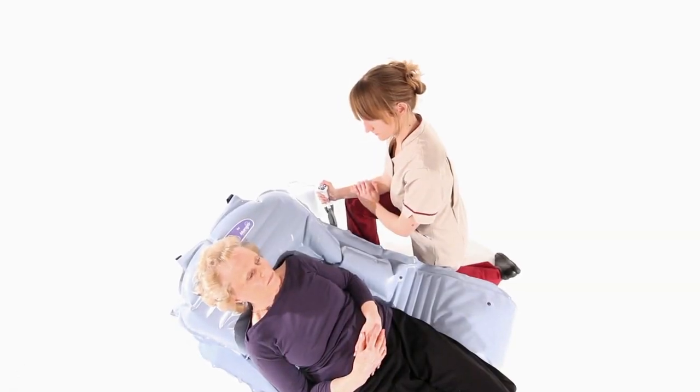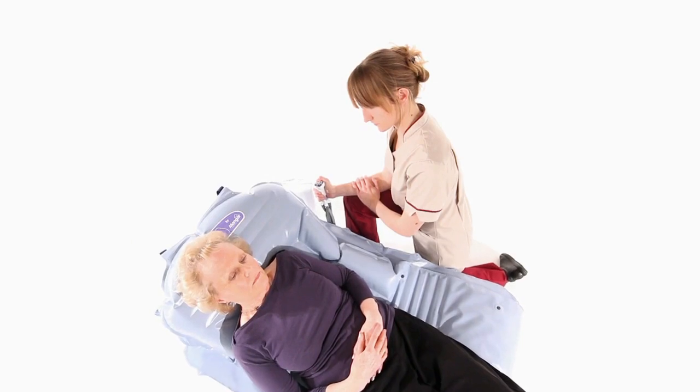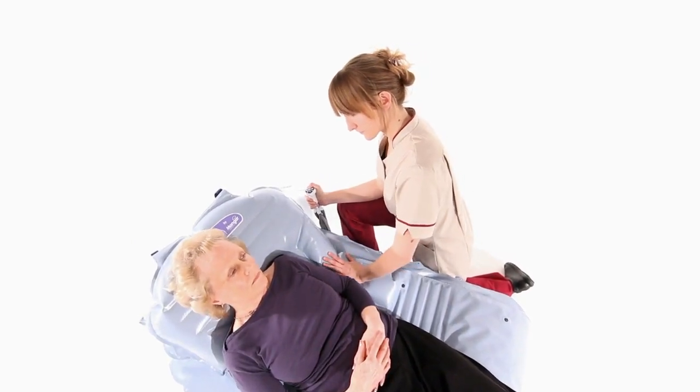An uneven lift may occur if the person is not positioned centrally on the Camel. This can easily be corrected by placing your hand on the opposite side.